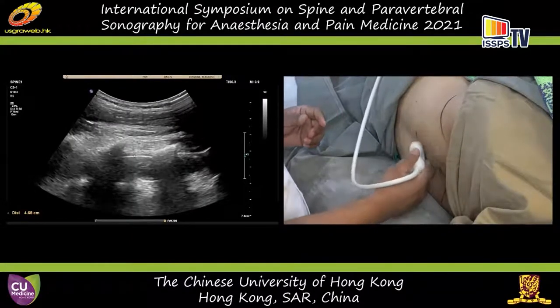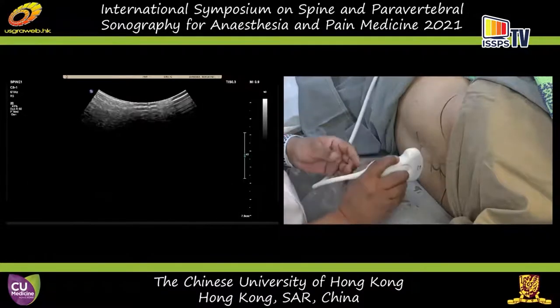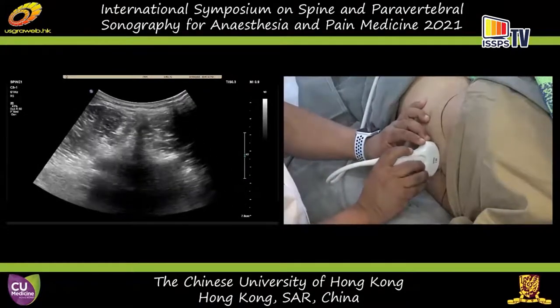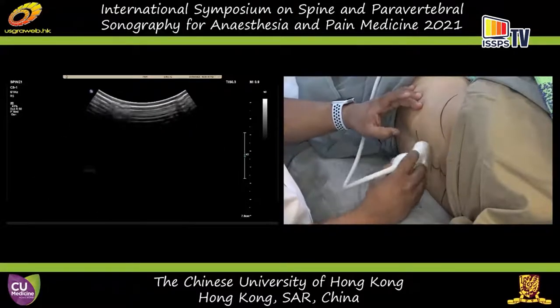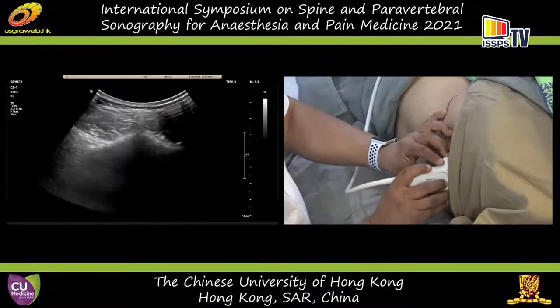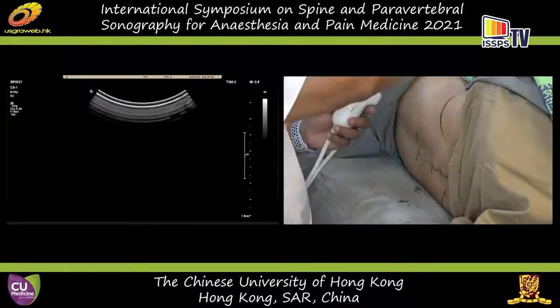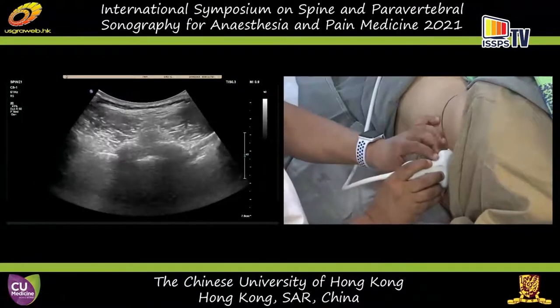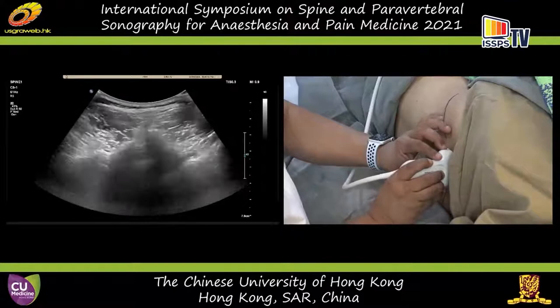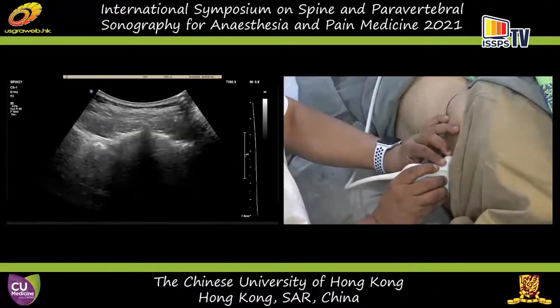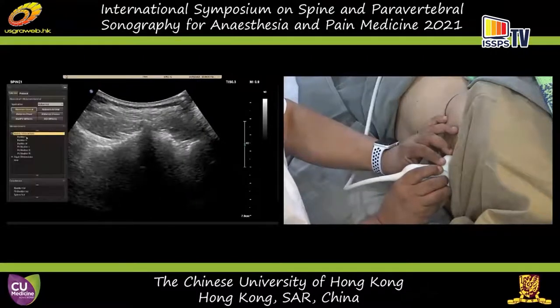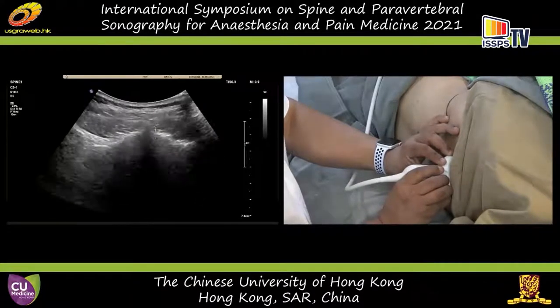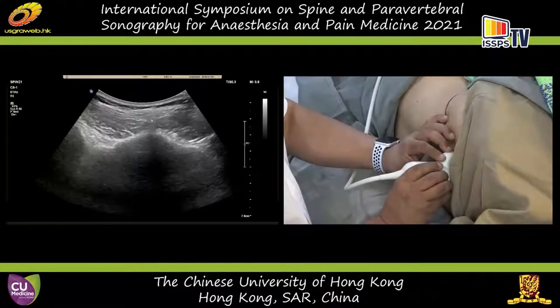I would also like to show you the transverse view, which can be useful. When we do the transverse scan, the orientation marker is pointing to the right of the patient. Let's start from the sacrum. Here is the median sacral crest in the midline. You can see the sacroiliac joints are laterally, and the iliac crest would be further out. Now we are going to move the transducer cephalad.